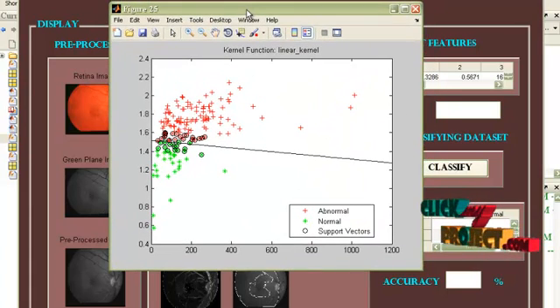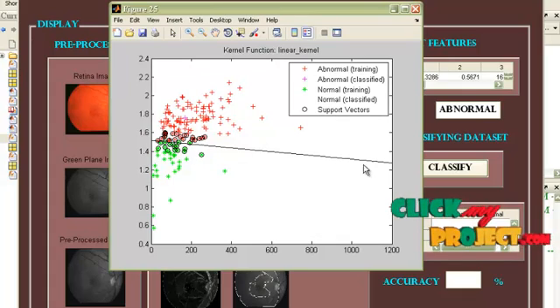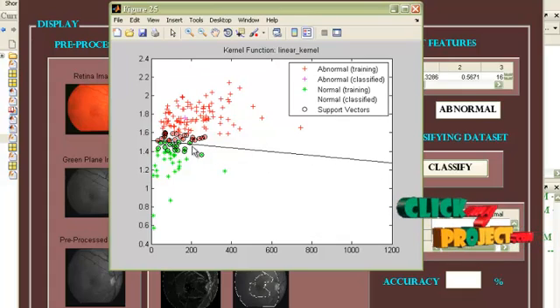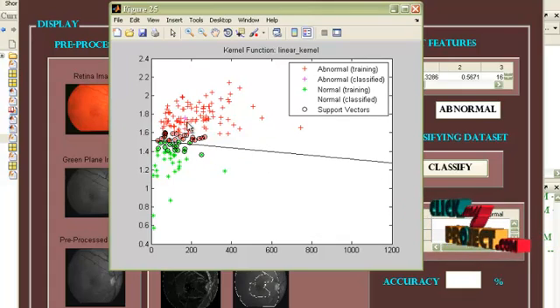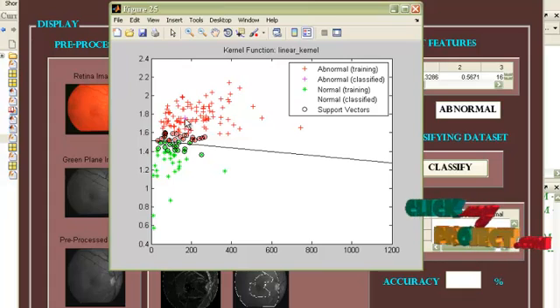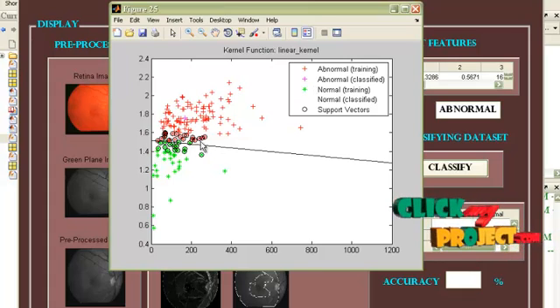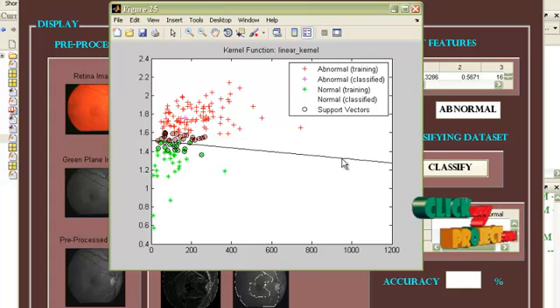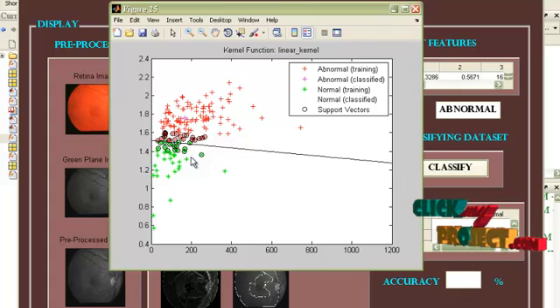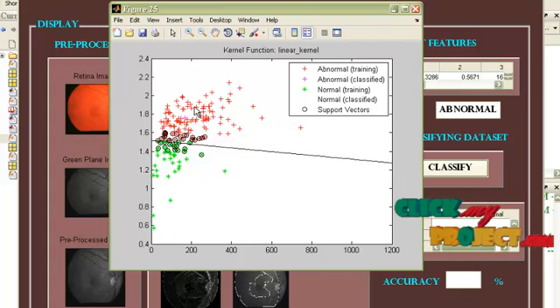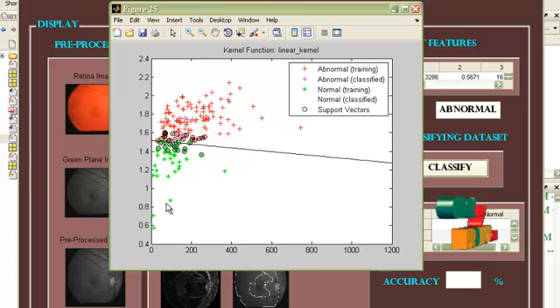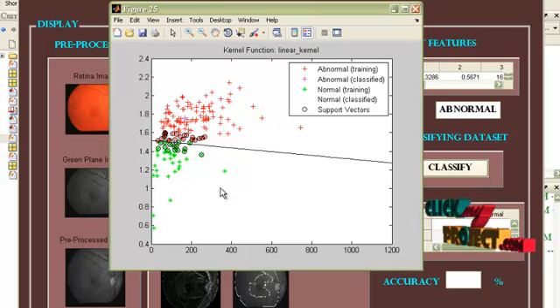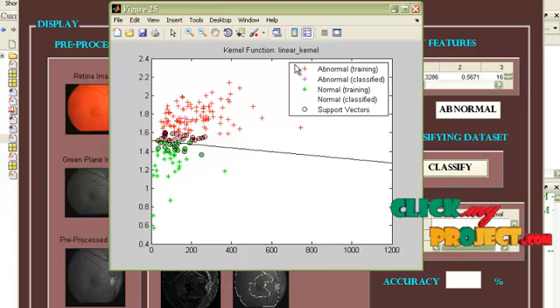And we have to classify this. Since we are using an SVM classifier, it is a binary classifier. Our abnormal image is classified here as abnormal in the pink color. This is the hyperplane representing the distinct features between normal and abnormal. And this is the support vectors. Green samples are represented as normal. Red samples are represented as abnormal.